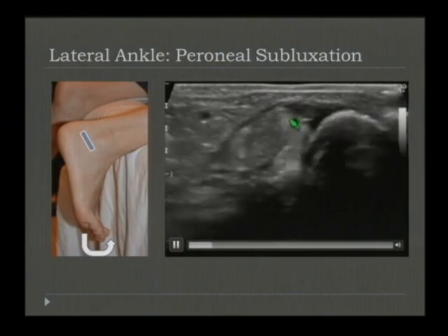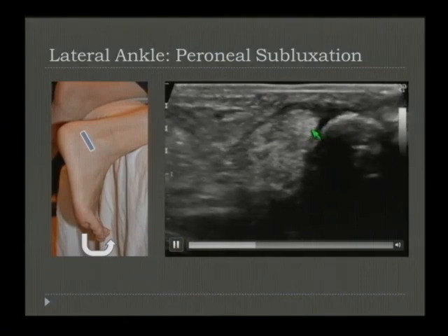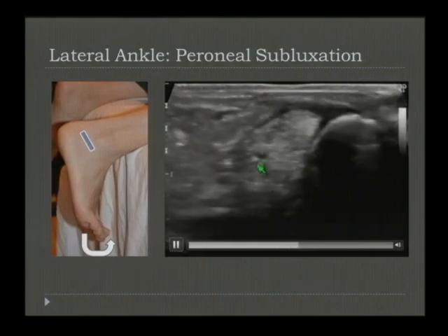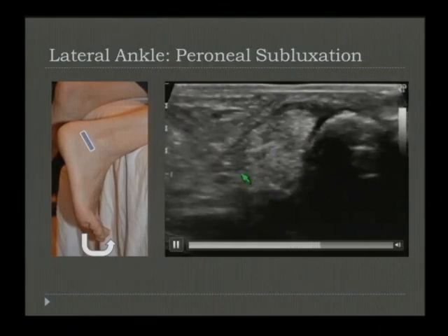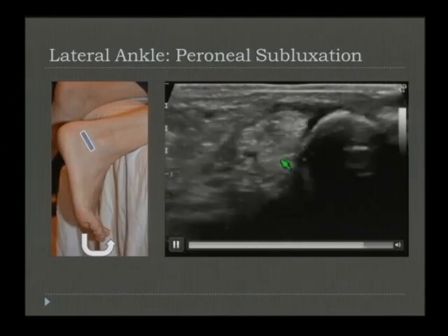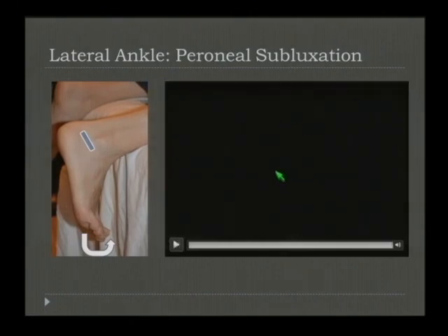You can see all of a sudden the longus just snaps right over the peroneus brevis. Again, here the patient's getting stuck or having trouble actually relocating it at this point, and you'll see it'll finally relocate. And then once it relocates, we unfortunately kept making them do circles, and then they slipped out again and pop back and forth. It was diagnostic for a type 1 injury. They actually did have an MRI before this ultrasound, which was read as negative.